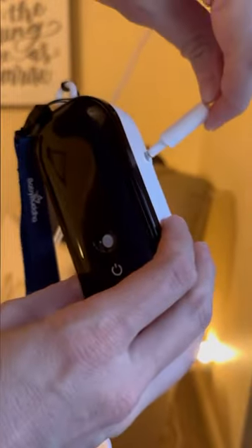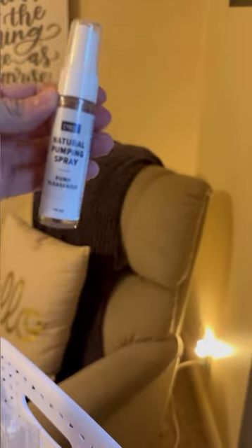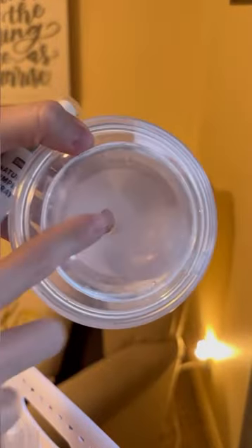Then you're going to plug in the other part of the cord into the Baby Buddha motor. I highly recommend getting a pumping spray that will help lubricate as you pump.